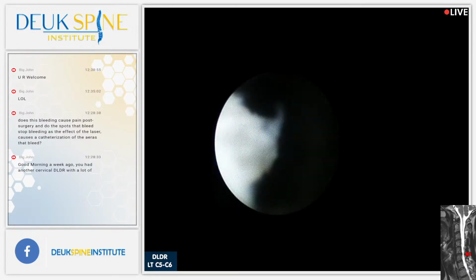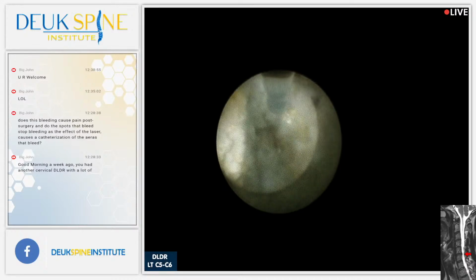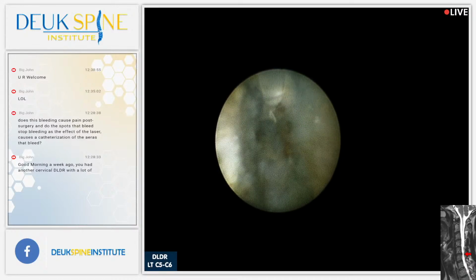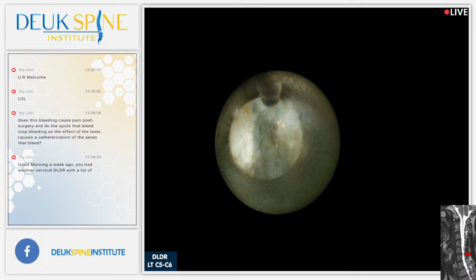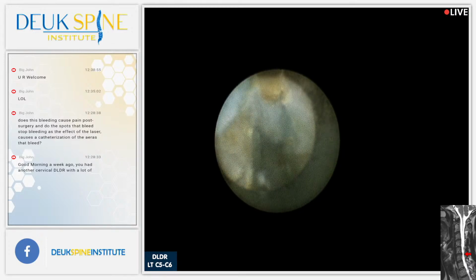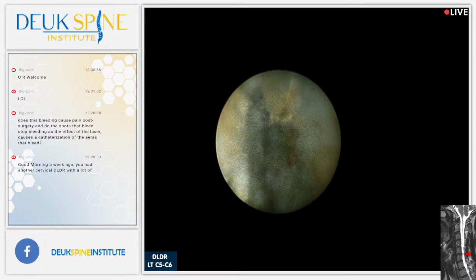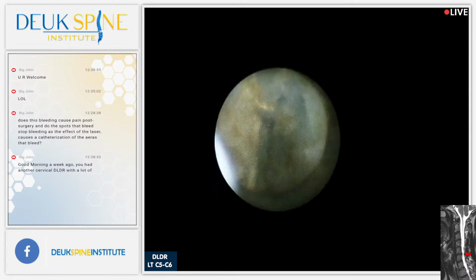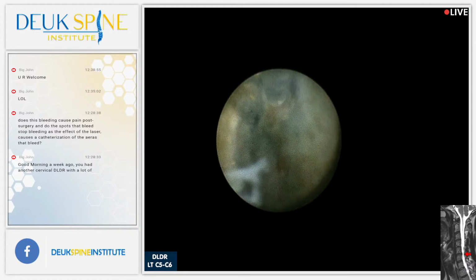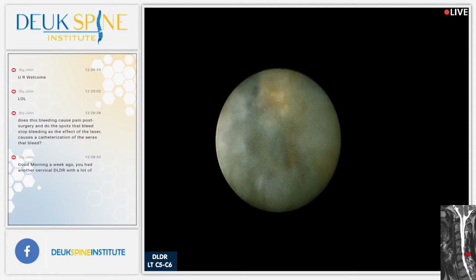Gosh, a lot of herniation. See all this stuff? It's like snowflakes. I say 1 more minute, we'll be done, unless something weird happened and we suddenly find a ton of herniation.